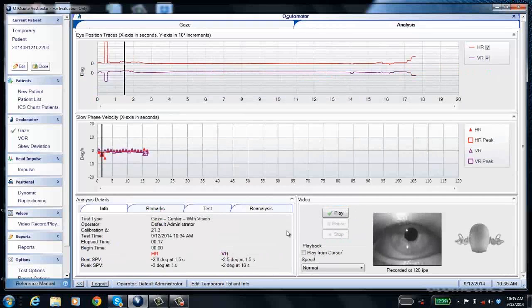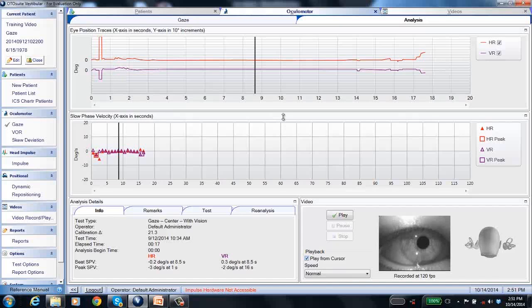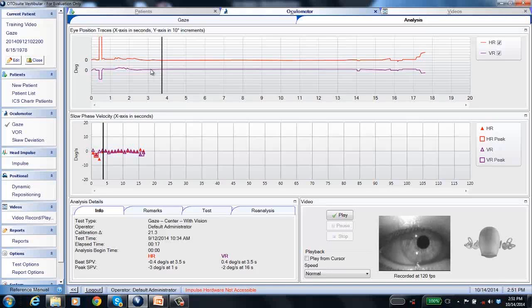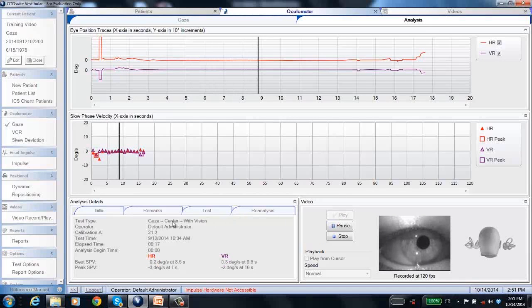Once you're done with the test, you can play back the data — the trace, the eye video, and either the head position feedback or synchronized room video, all synchronized together. You have a couple of playback options: click the cursor at a position and choose 'play from cursor' to play from that point to the end, or if that box is unchecked, it always plays from the beginning. Wherever you click along the trace, the corresponding eye movement and head movement are shown, and the beat position jumps to match.